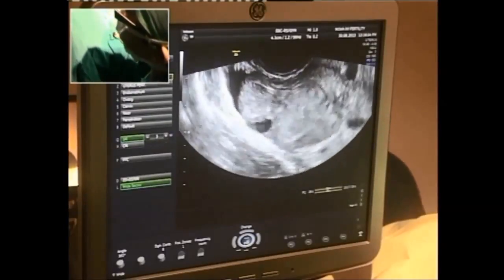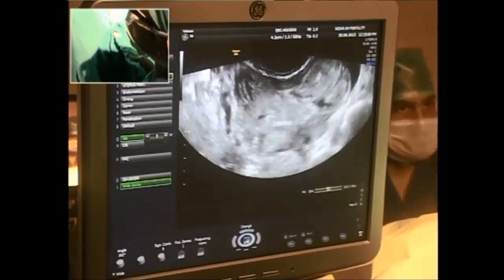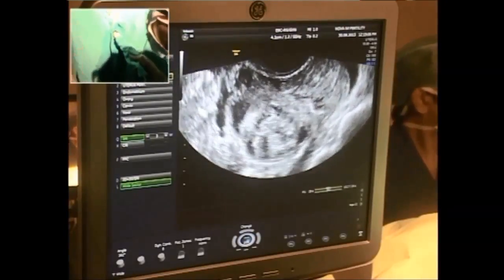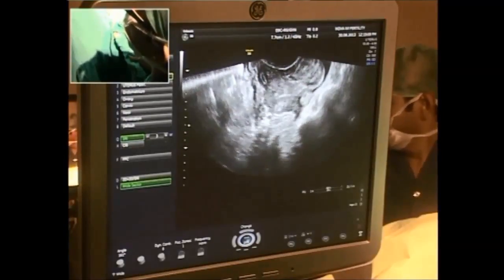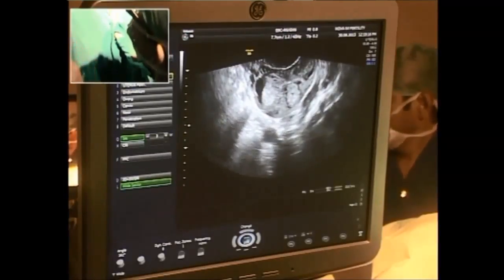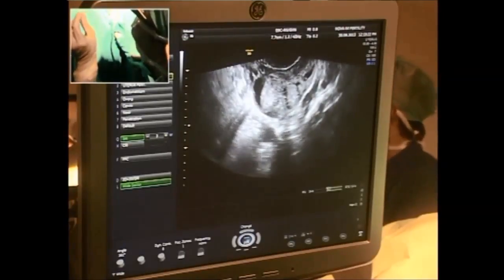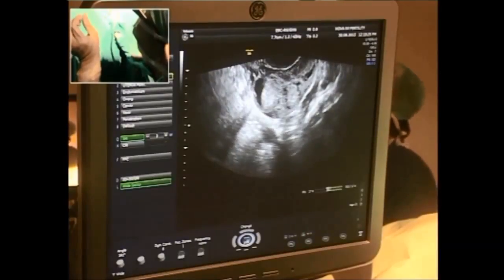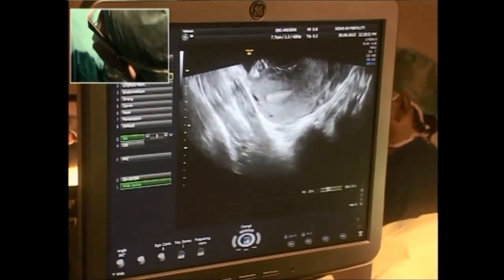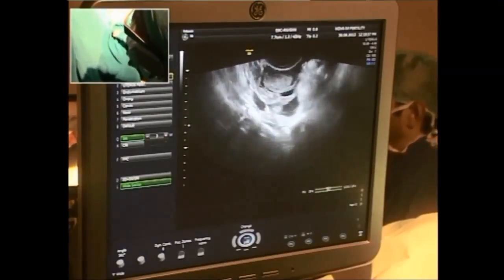What exactly do you do with a single lumen to ensure the egg doesn't get stuck to the wall? That's a very good question. What I do is slowly withdraw the needle as the aspiration is going on, even inside the follicle. Once we have reached about one third of the follicle, I try to rotate the tip slightly. It's called curating the follicle — to curate it of all the oocytes.